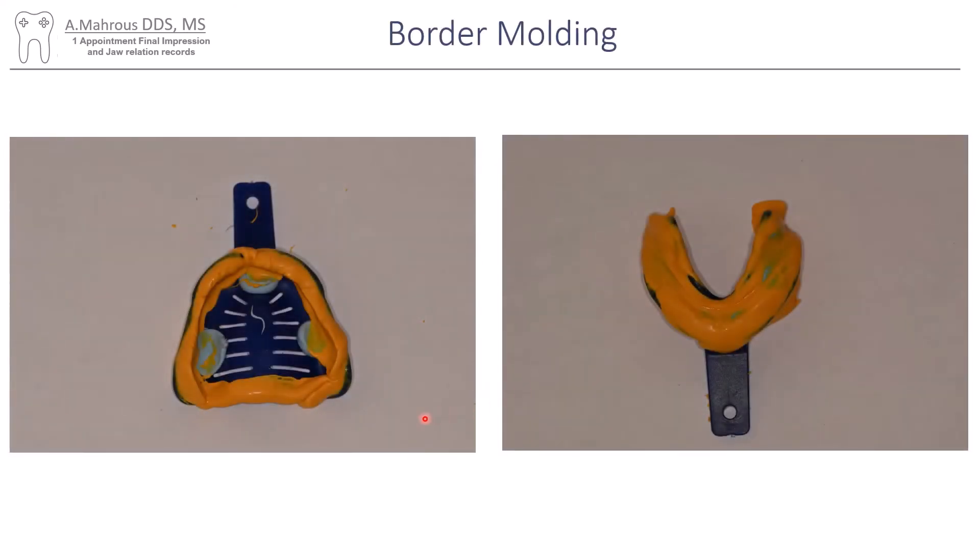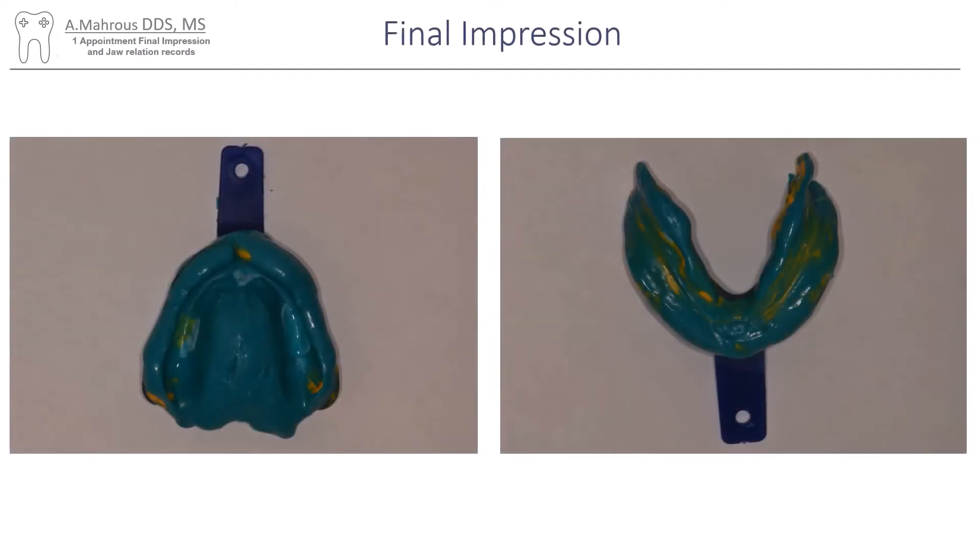Then it's border molding time — this is me border molding with 3M PVS. You can see on the mandibular arch it's almost like a wash impression, just because of how resorbed everything was. Then the final impression comes next; on the maxillary it's just like your traditional final impression, and on the mandibular again it's almost like a wash over the wash that we had done previously.